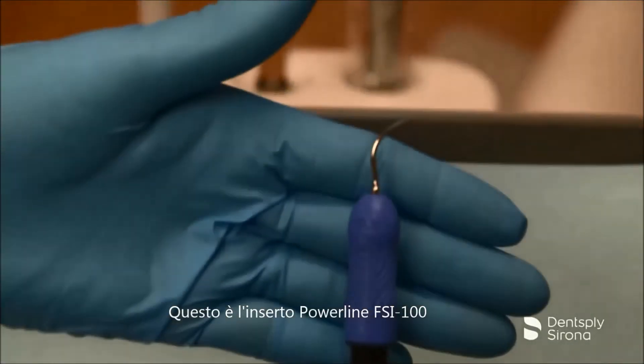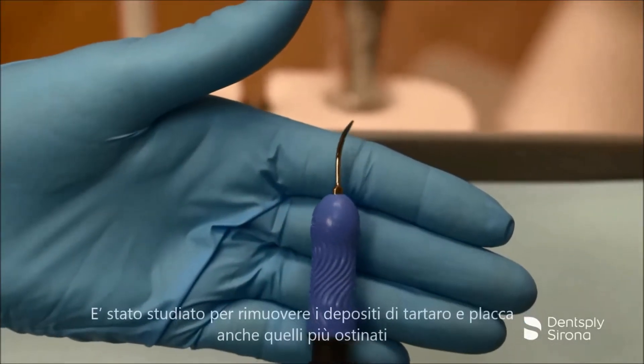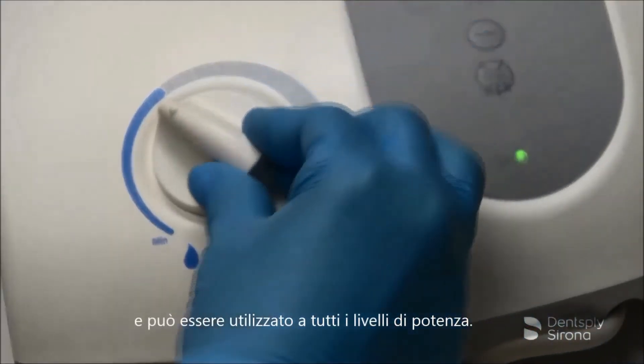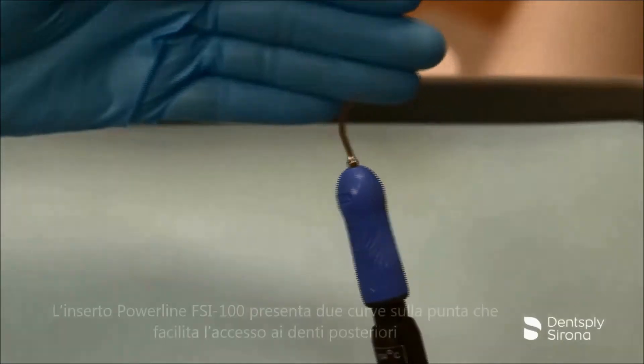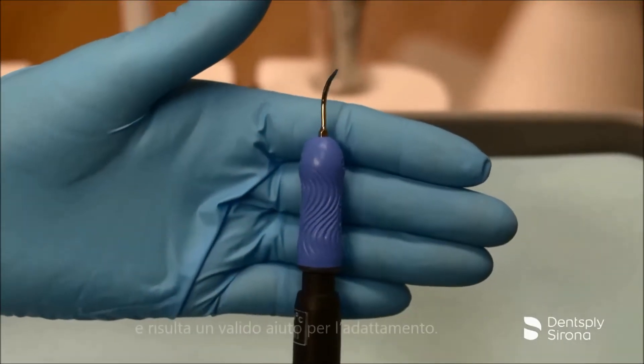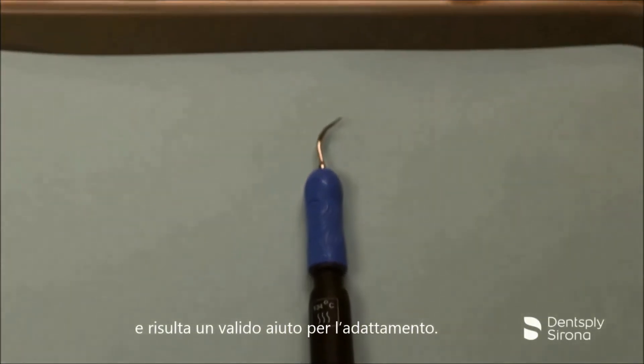This is the Cavitron FSI 100. It is designed for removal of moderate to heavy deposits and can be utilized at all power levels. The Cavitron FSI 100 has two bends to the shank, facilitating access to posterior teeth and aiding in adaptation.